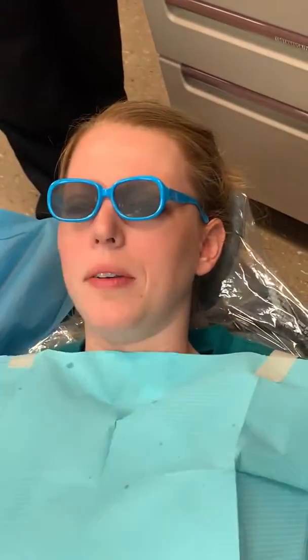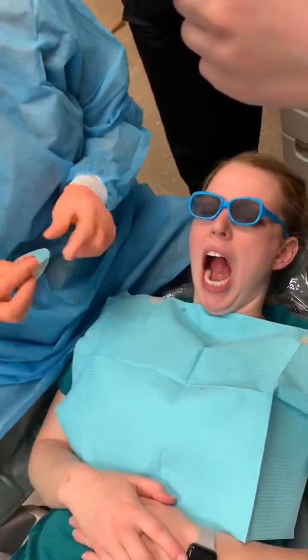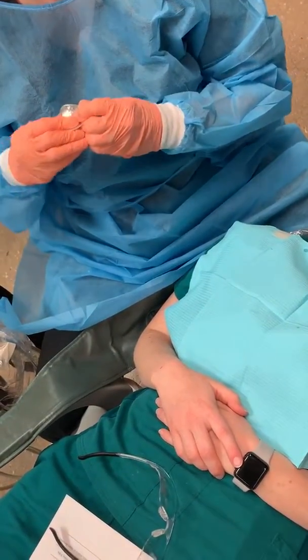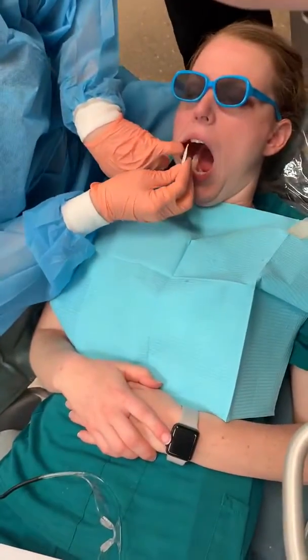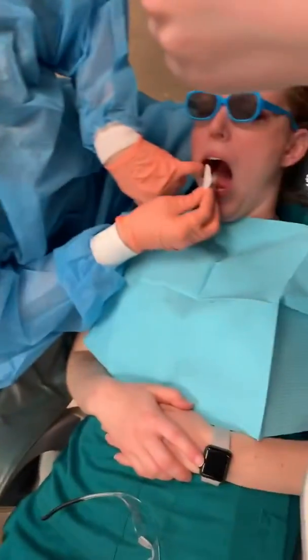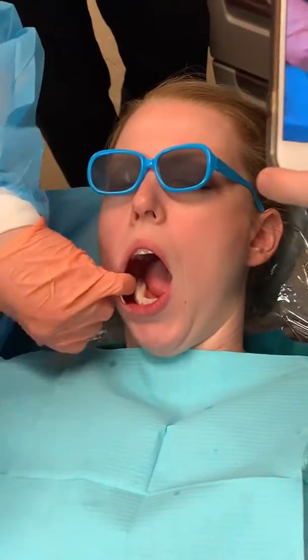Now you want to place your isolation. We're going to use a dry angle to cover the parotid gland. The silver side — if it has one, some of them are white and white — goes towards the inside of the mouth, and the white goes towards the cheek. I'm going to bend this a little bit because if you don't bend it, it can be kind of pokey. I'm going to stick this right back here to control that saliva.